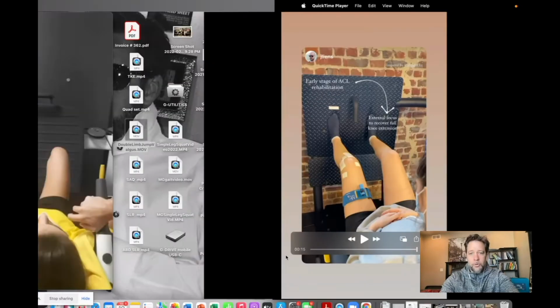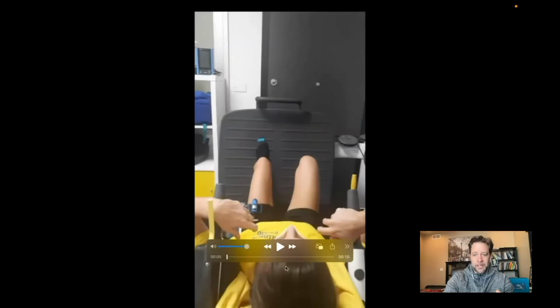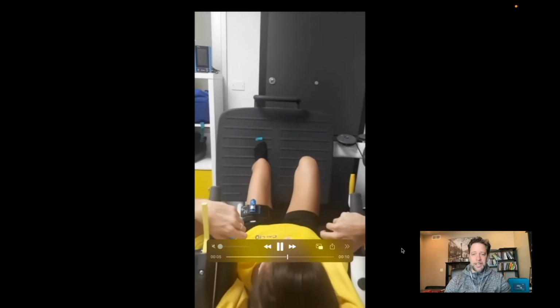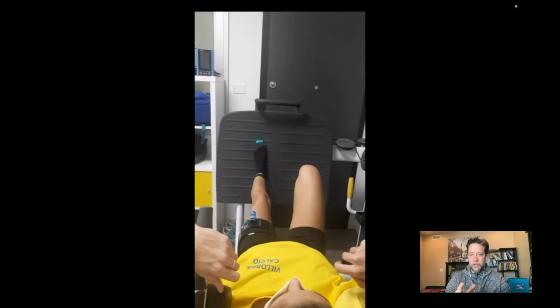All right. So that's post-operative. As you start to progress these people, you could progress them into single leg stance. Okay. Further into the rehab process. Same activity, but you can see the laser really start to struggle toward terminal knee extension for control. And you can see your knee moving around there. Okay. That's going to be great feedback for you and the patient. Even if they don't want to look at it, you could record that with your phone and then show it to them later and see if they're starting to have abnormal movement. See, is there? Okay, there we go.